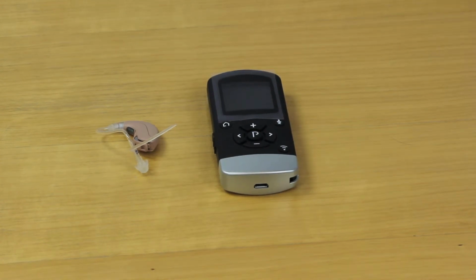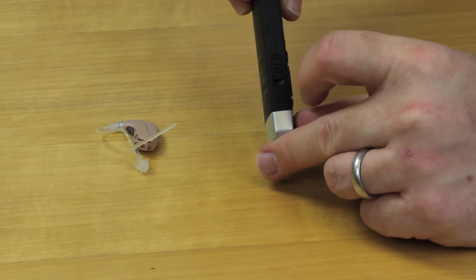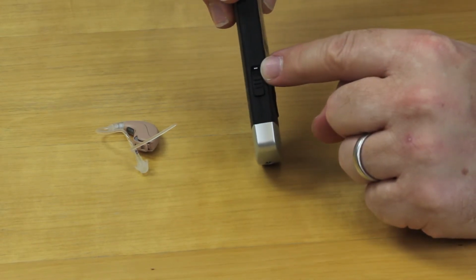The remote must be turned on. Do this by pulling downwards on the switch located on the side of the device. On is represented by a single vertical white line, as shown.